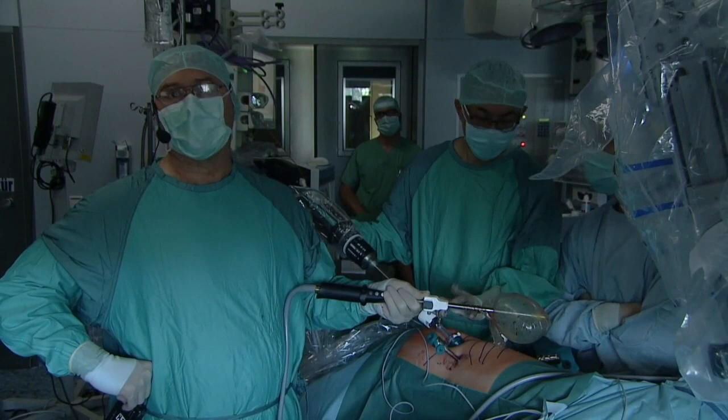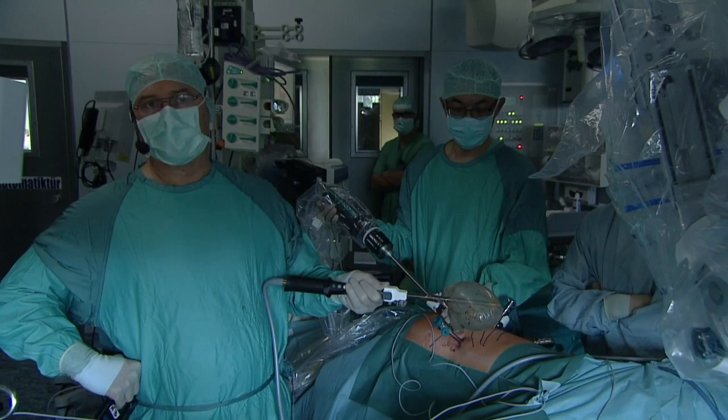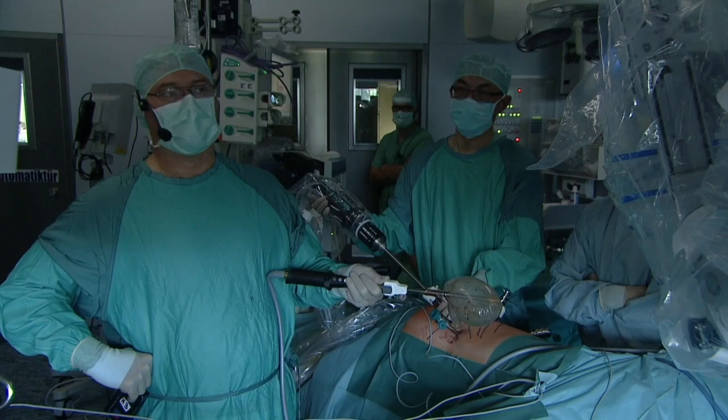At any rate, this woman has a 5.5 centimeter left lower pole tumor, somewhat posterior, but mainly lateral. The tumor is quite deep and extends into the sinus. There are multiple vessels, and we are going to attempt to do this retroperitoneally using the Da Vinci SI robot.